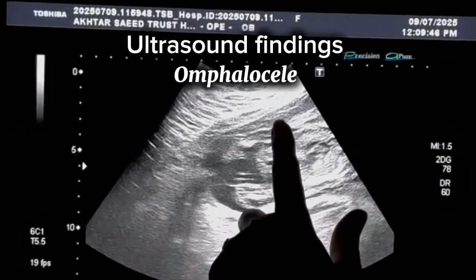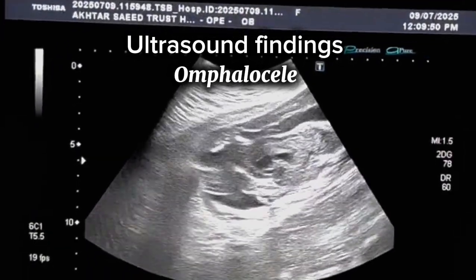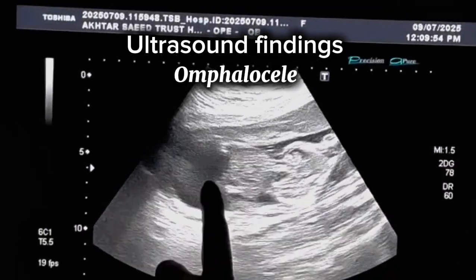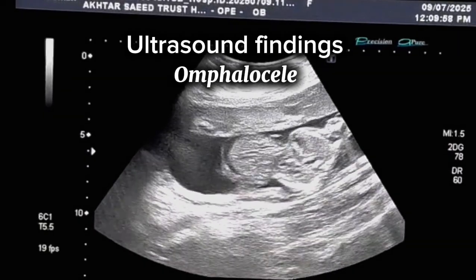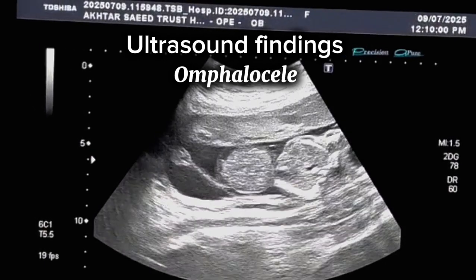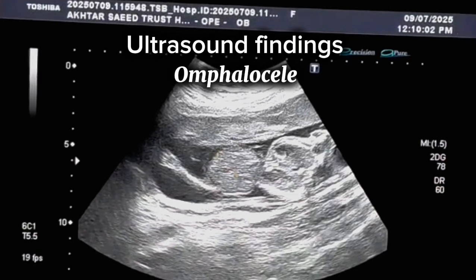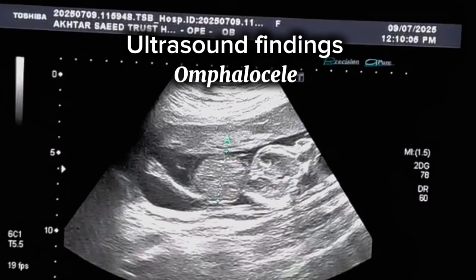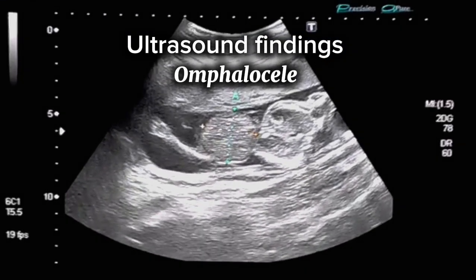A moderate amount of free fluid was noted within the fetal abdomen. This was suggestive of non-immune fetal ascites. Bilateral clubfoot was identified. No limb shortening or bony abnormalities were noted. Amniotic fluid index was within normal range with no evidence of oligohydramnios or polyhydramnios. Other structures including cranium, spine, and kidneys appeared structurally normal. No intracranial abnormalities or spinal defects were noted.